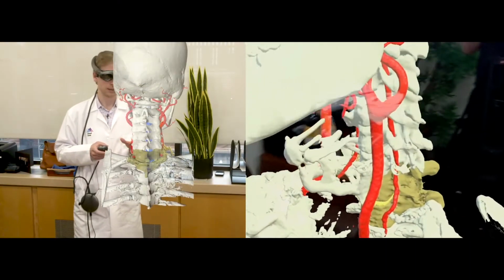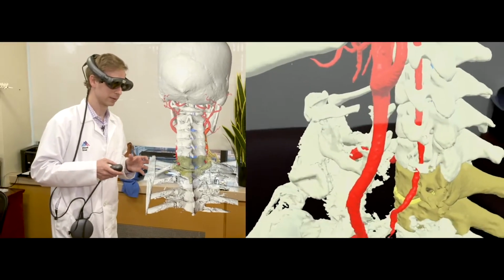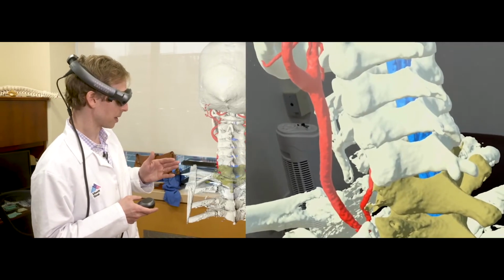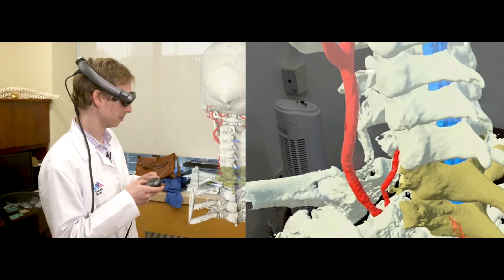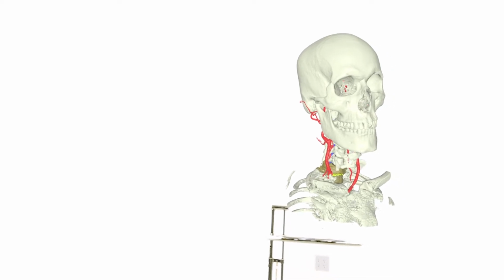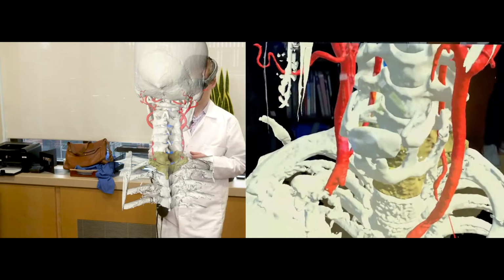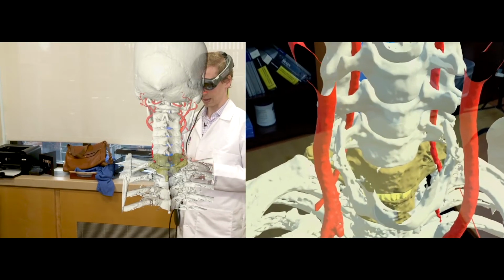As you can see, I'm taking a little tour of his spine, walking around from front to back. You see blue is spinal cord. You see a beautiful picture of the bony landmarks coming around the front. You see the way we actually look at it during surgery. And if you walk toward it, you can really see exactly how we see the front of the spine in surgery.